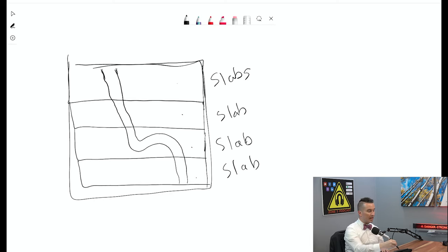So in the slab, in the 3D time of flight, we're going to excite, and it's going to be slab specific. Only this slab is going to be receiving the RF to become excited. Now, when you say excited, are the protons that are excited the ones that are in phase? No, just the protons inside receiving the 90. Okay, I see. So they're the ones we're focusing on.